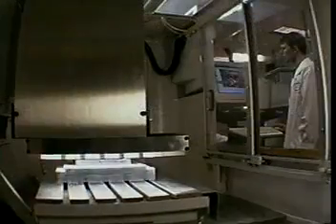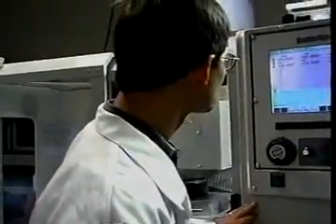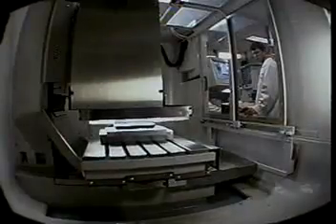What a destructive scanning machine does is remove paper-thin slices of about 3/1000ths of an inch, with the digital camera taking a two-dimensional scan after each slice. A computer stacks together around 300 of these digital images to create a three-dimensional model. So now the computer harbors a highly accurate record of the patient's teeth, as well as the interproximal spaces between them, as they are found in the physical world.